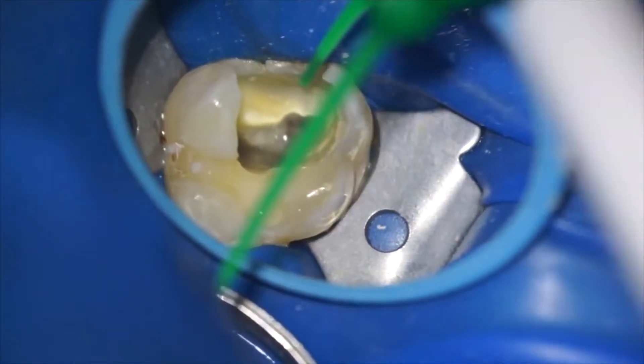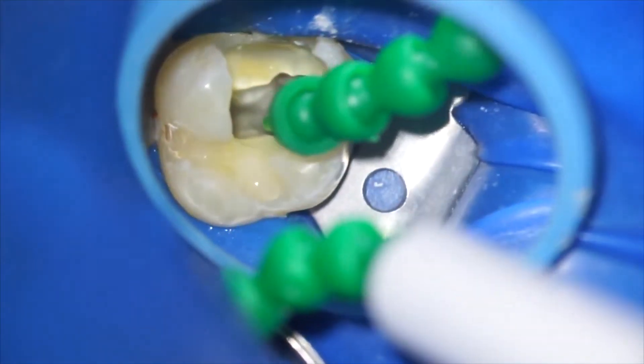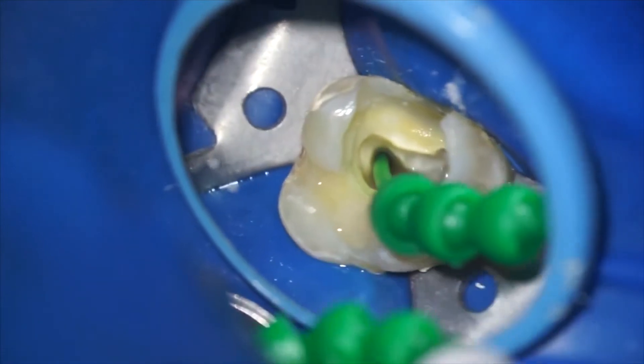Also, if any solution is left behind, it could affect the set of our sealers, or what we use to fill the canal.